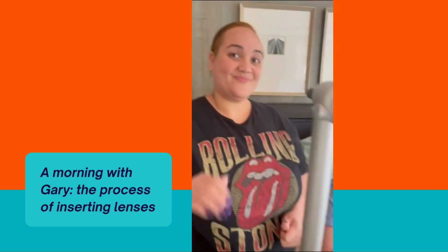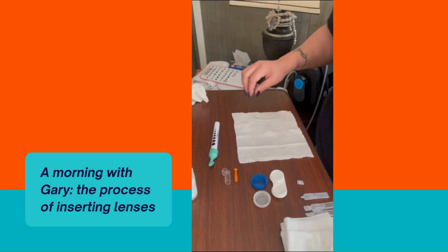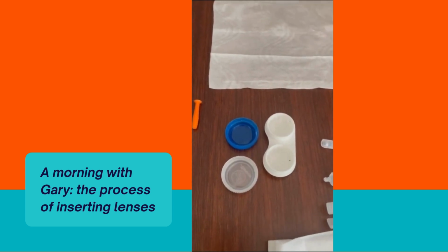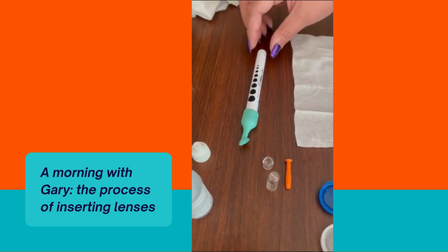So this is Bernadine, one of our caregivers. Hi. Bernadine is the best at putting contacts in. All of us can do it, but she's the best. So we thought we'd show you some of the tools that we start with. Obviously, we've got Gary's contacts, and we'll talk about the fact that they are marked in a second. We've got Bernadine show them the insertion tool.